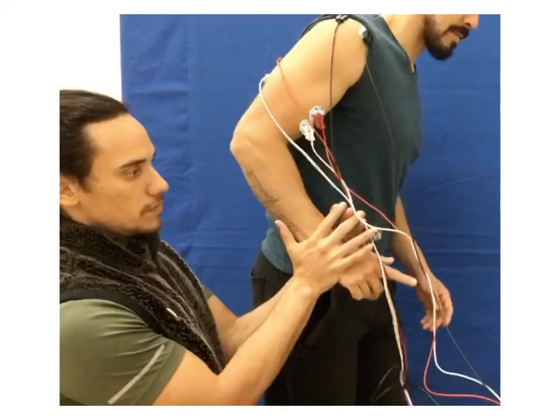So how do we obtain MVC? A lot of people want to lift a heavy weight. The best way is just manual resistance. So you can see this is going to be elbow extension. So we're going to be trying to get MVC of the triceps brachii. So we're looking at the elbow joint.